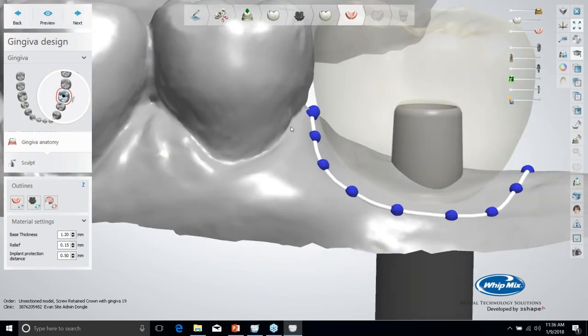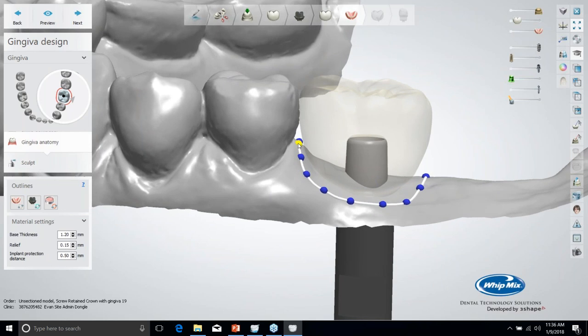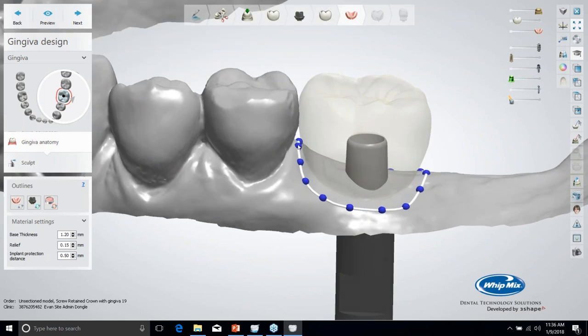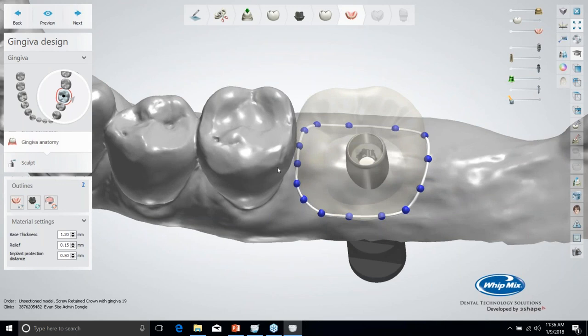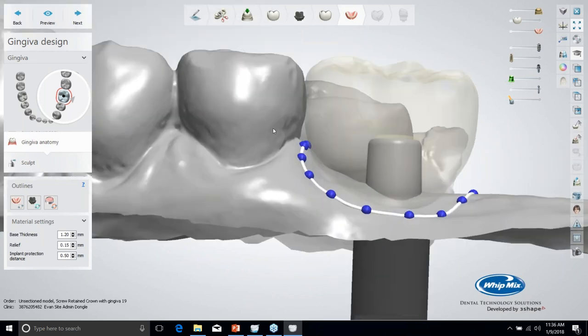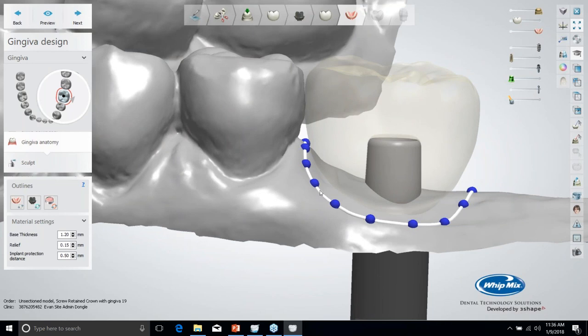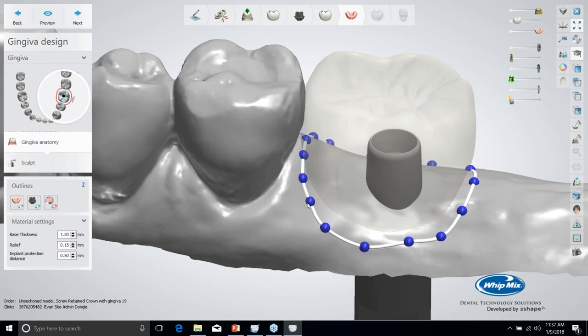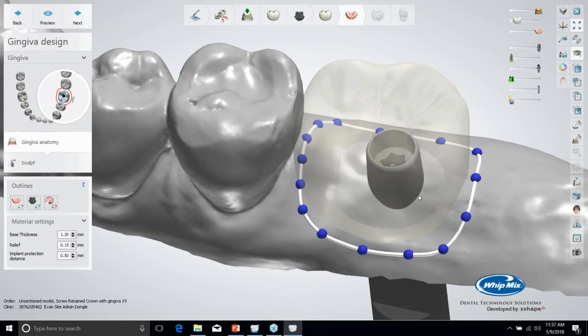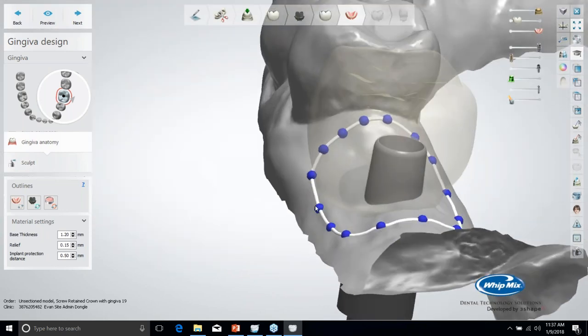One important thing to note is when you're doing this border, especially where they have existing teeth, you've got to be aware that you can't pull this up close to that adjacent tooth because you're going to create a draw issue there. On a full arch restoration, it doesn't matter because they're fully edentulous. So I just want to make sure I'm not into the undercut of that tooth. You do want to make sure that you have this border the way you want it, because you can't change it after this step. You can back up and get back to it, but that adds more time with recalculating and stuff like that.